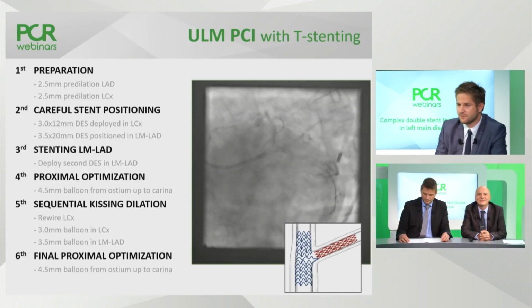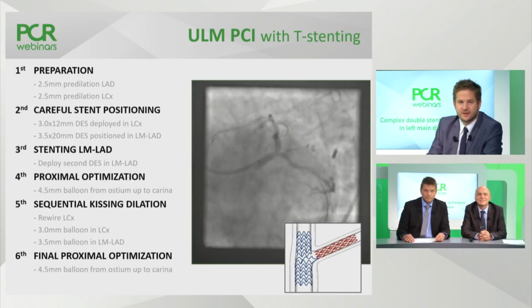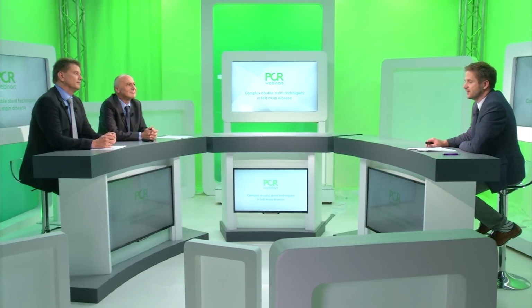So before we move on to the second case, there are some questions from the audience which we can quickly address. First of all, is it necessary to use a balloon pump for this case? What was the Killip class of this patient?